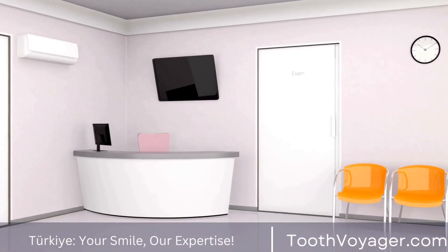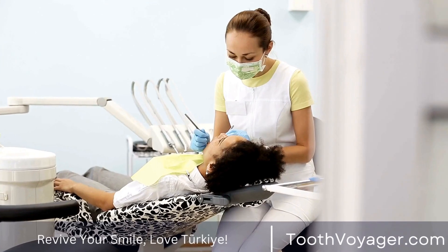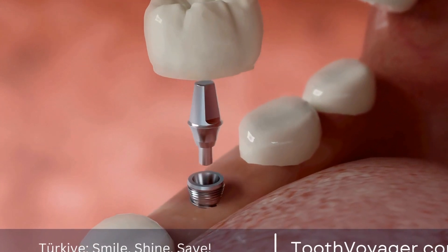Metal crowns are extremely strong and resistant to wear and tear. They are often used for back teeth where strength is a priority. Common metals used in dental crowns include gold, silver, and platinum.